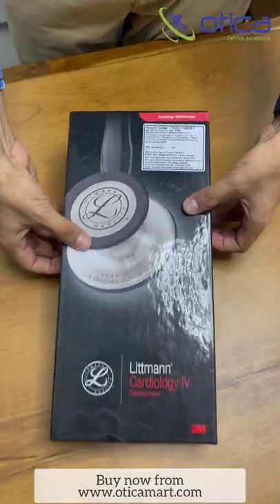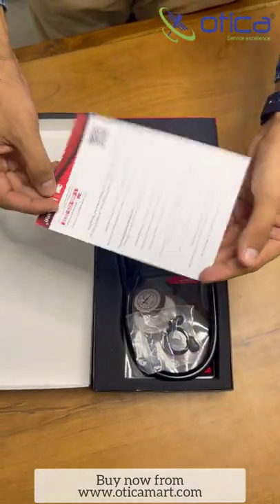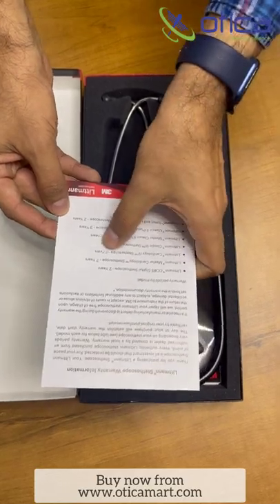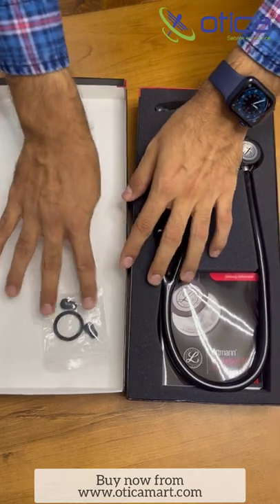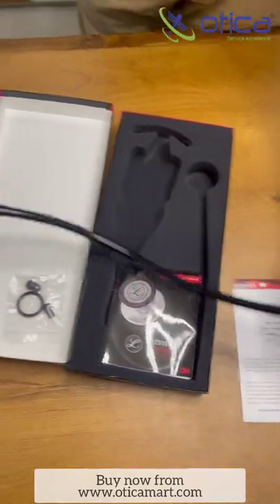We are just going to open it. You can see the company has provided a warranty card, and this device is having seven years of warranty. The company has also provided three spare parts extra.